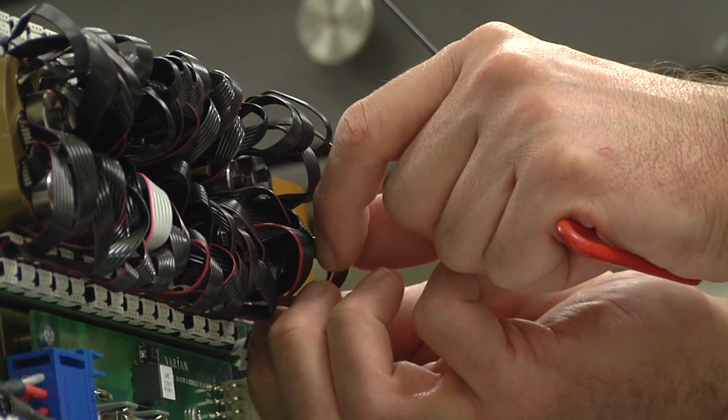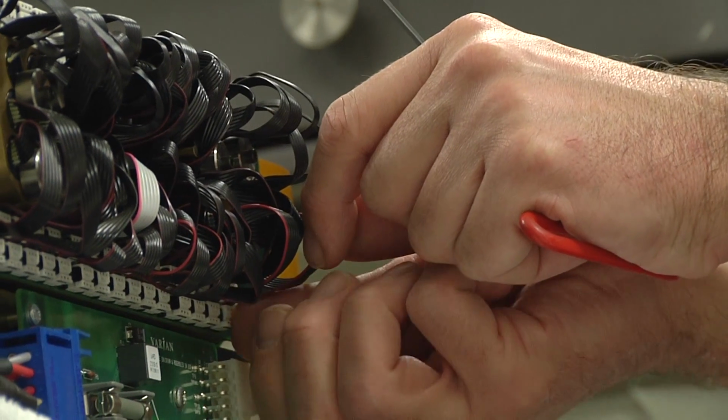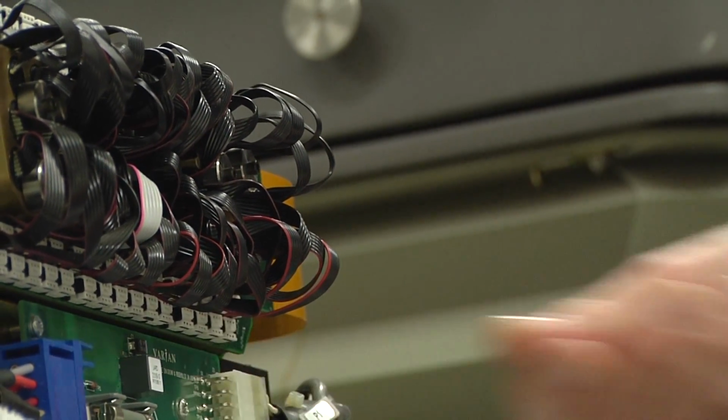Yeah, I was going to say, exactly. Looks like something to grip at that point. You can see why you put the sheet there to help. Yeah, because I can easily see it.